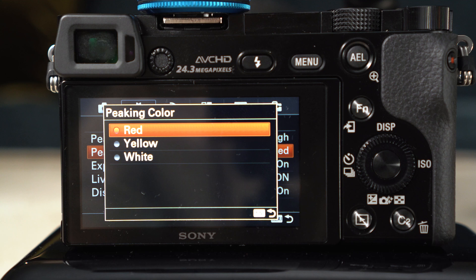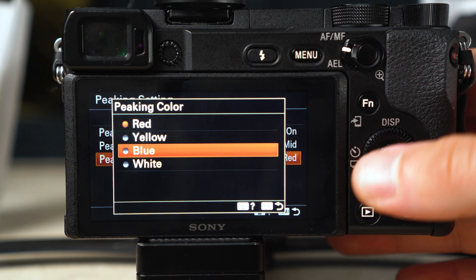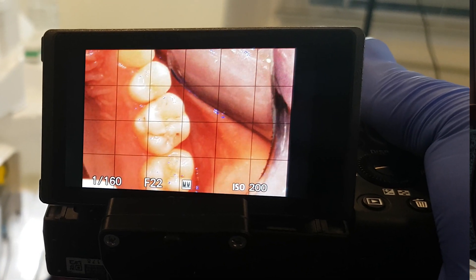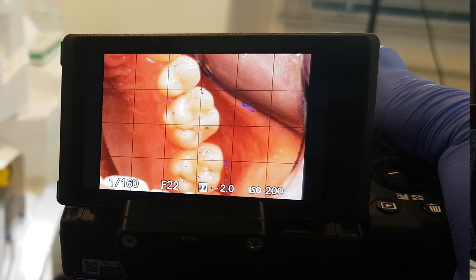The difference between these two cameras when it comes to focus peaking is the colors available. The a6000 has white, red, and yellow, but the a6400 also has blue. Blue is great because we rarely see anything blue in the mouth, so the focus peaking dots are very easy to spot. On the a6000 you have to use red, which can be harder to see because the gingiva and tongue are also red — a minor but significant difference.